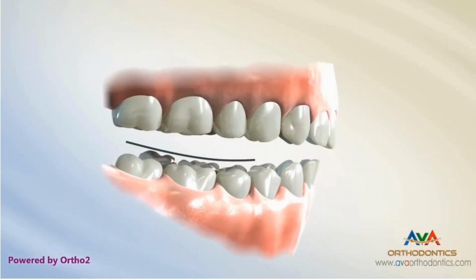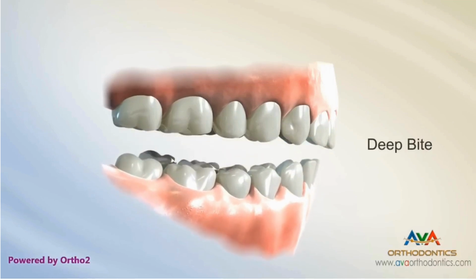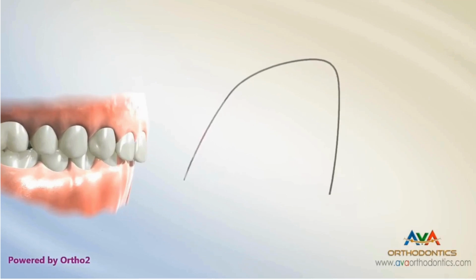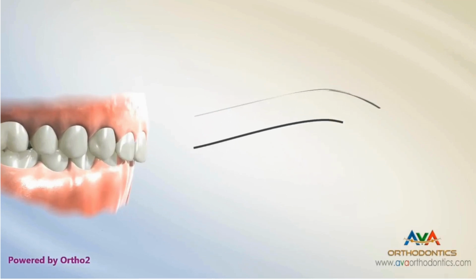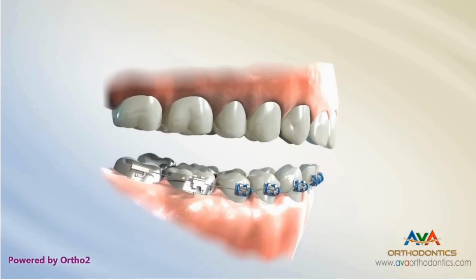In this video, we will see how the reverse curve wire is inserted. Reverse curve wire is used to treat deep bite patients. In the lower arch, the reverse curve wire has its curvature in a downward direction. It causes intrusion of anterior teeth and relatively extrusion of posterior teeth and treats the deep bite patient.